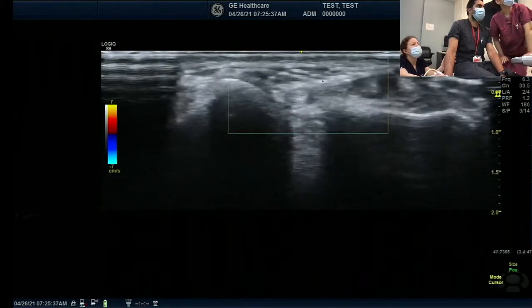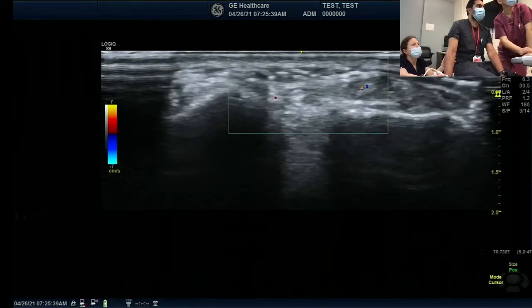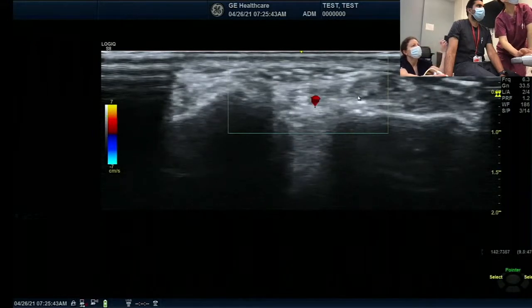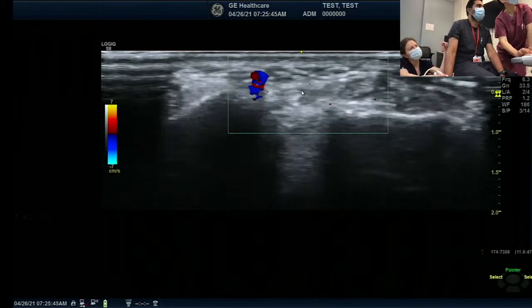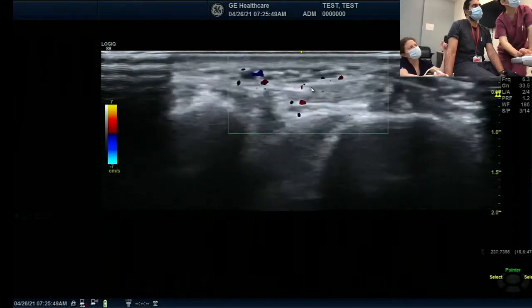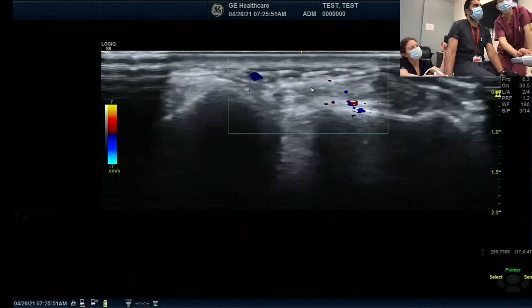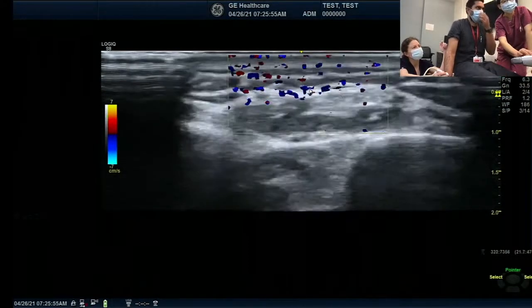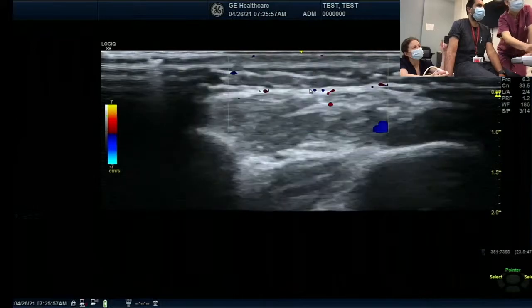Let's find out over there. Oh, here I see. Cursor. Posterior interosseous artery is here. So the nerve is going to be here next to that, right? Yeah. Very good. I hope that everybody agrees. Because when Divas practices, maybe we all agree.